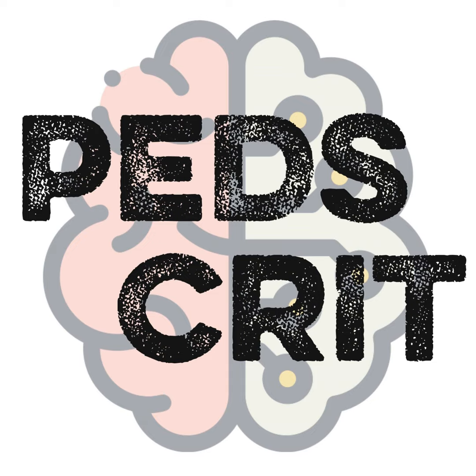That's a common thing. And what is really important to understand, if you have a patient on the oscillator with a sudden, unexpected increase in CO2, it's always either a pneumothorax or an endotracheal tube obstruction. Ruling out the big things, always. So let's say your patient was relatively stable and all of a sudden, out of nothing, the CO2 went from, let's say, 50 millimeters of mercury to 100 millimeters of mercury, it's either a pneumothorax or an endotracheal tube obstruction.